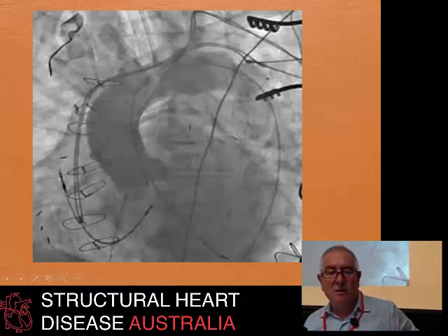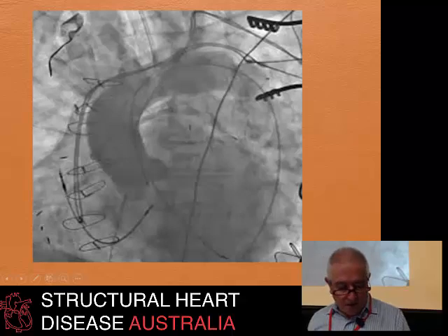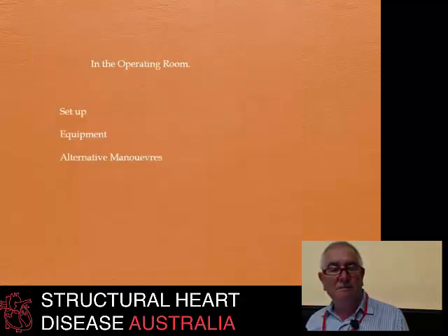And of course, there's always someone who'll present you with a problem that you never ever expected, and here's a pacing lead down into the left ventricle. Now clearly, if you're going to take that out, you're going to be dealing with the subclavian artery, not the vein, and putting a 16 French cannula in there has got its own specific problems.